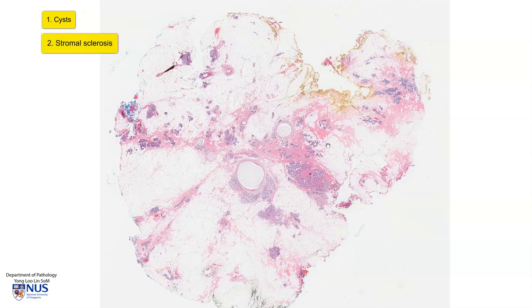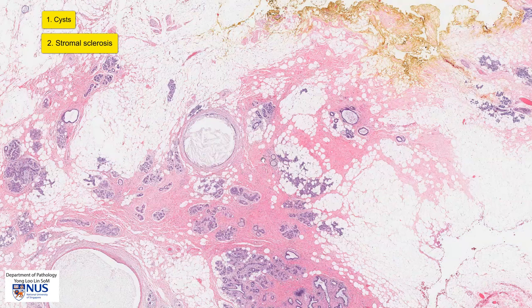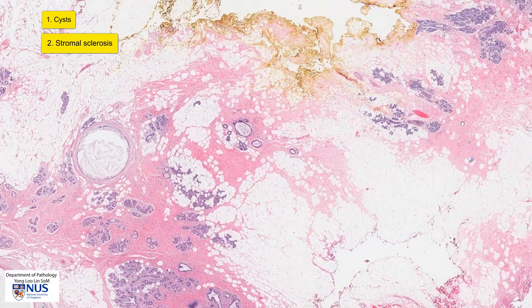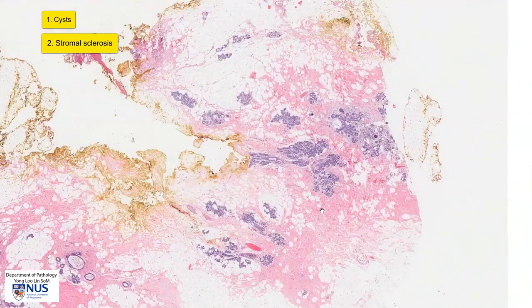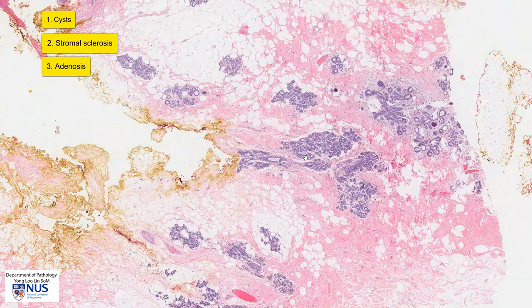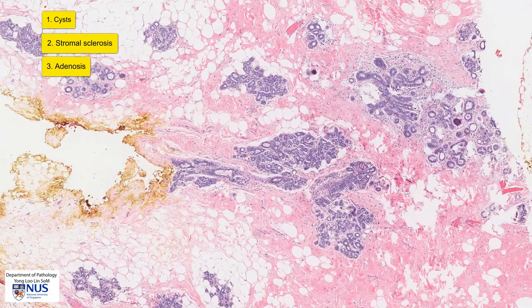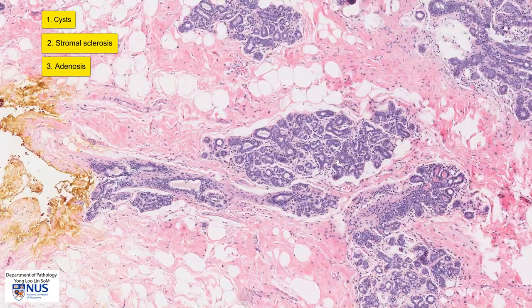The second component is stromal sclerosis, seen in these pink areas of collagen within the stroma. This stromal sclerosis contributes to the firmness of these lesions on palpation. There may also be areas of adenosis, as you can see here. Adenosis is defined as an increase in the number of acini within a lobule.